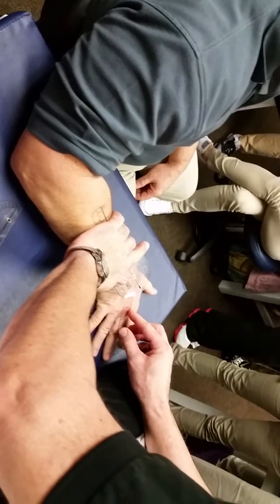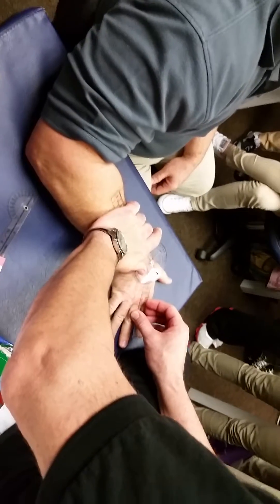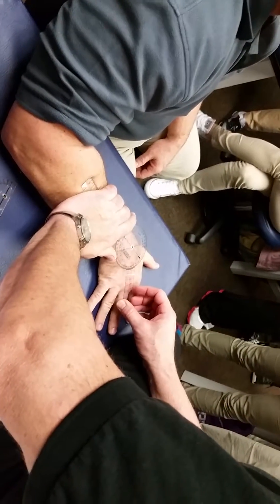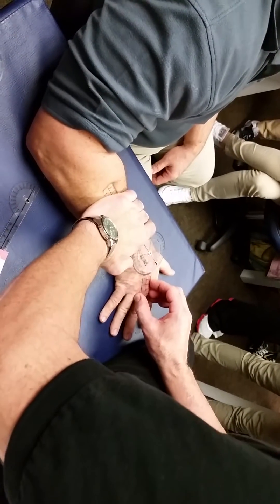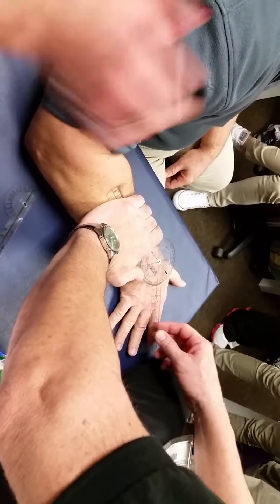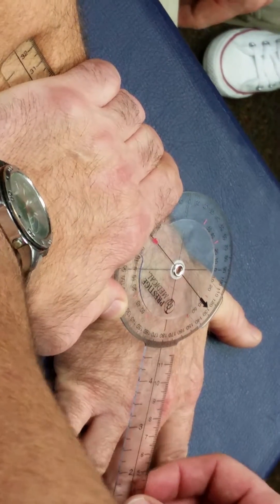So I'm going to be parallel — I can't be on that, because if I'm on that, the same thing would happen as with inversion and eversion. Now look where my axis is. I'm going to make sure the axis is in the right place and parallel with the knuckle. And he has 40 degrees of ulnar deviation. Make sure you don't go to the digit, because if I went to the digit, you'd be getting like 55 degrees of ulnar deviation, which he does not.